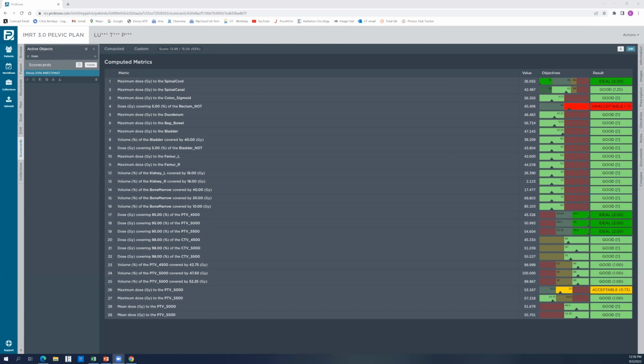Thank you. I want to go back and talk one more thing about the difference between 3D and IMRT and VMAT. If you have the choice to do VMAT, the therapists enjoy that more when they're treating, because it's a lot easier to do a VMAT treatment than IMRT or 3D. Yeah, absolutely. And it's faster for the patient as well, because you can complete one arc in as little as 1 minute, right? Right.